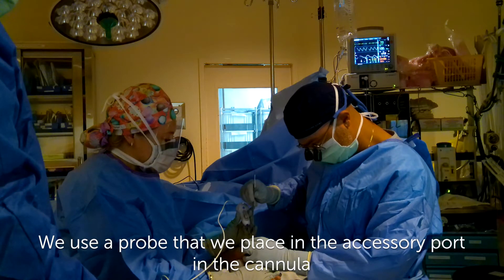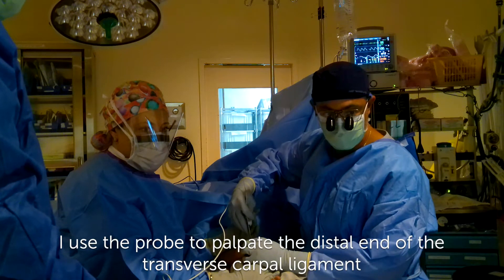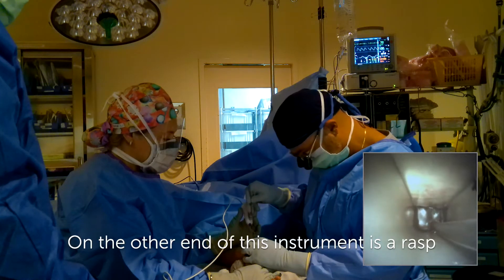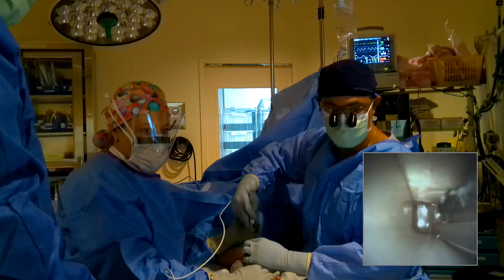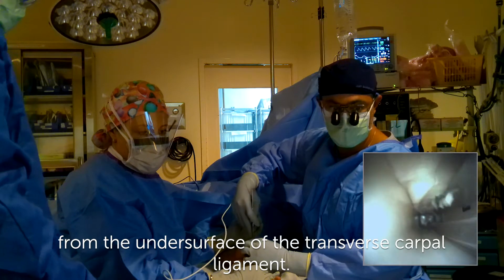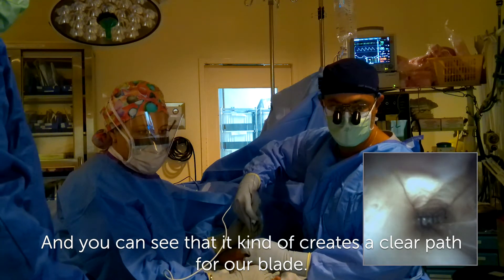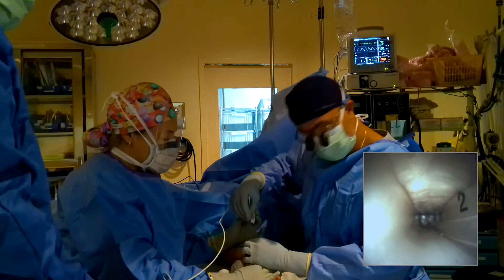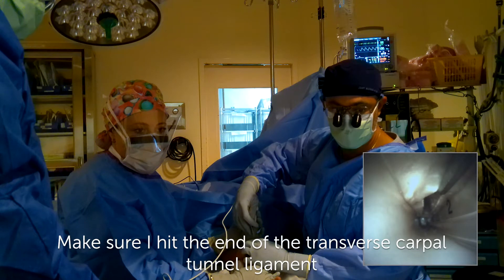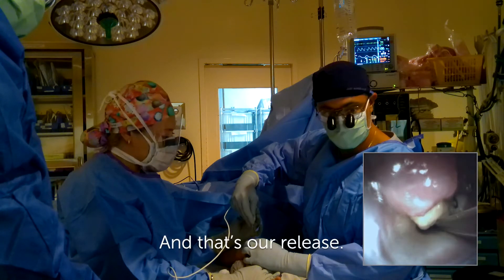We use a probe that we place in the accessory port and the cannula. I use the probe to palpate the distal end of the transverse carpal ligament, so you can clearly see it. On the other end of this instrument is a rasp that we use to scrape the tenosynovium from the undersurface of the transverse carpal ligament. You can see that it creates a clear path for our blade. We put the blade in under direct endoscopic visualization, make sure I hit the end of the transverse carpal ligament, and in a retrograde fashion — and that's our release.